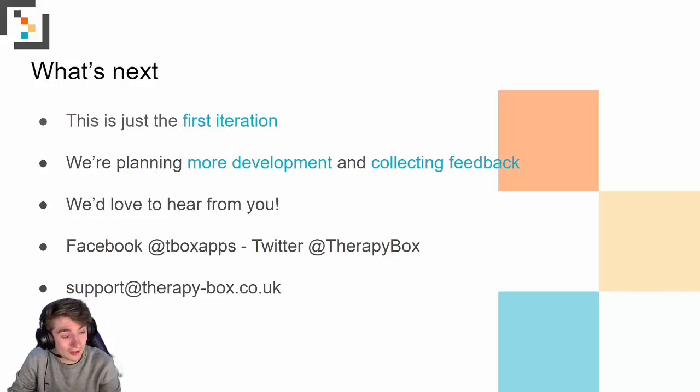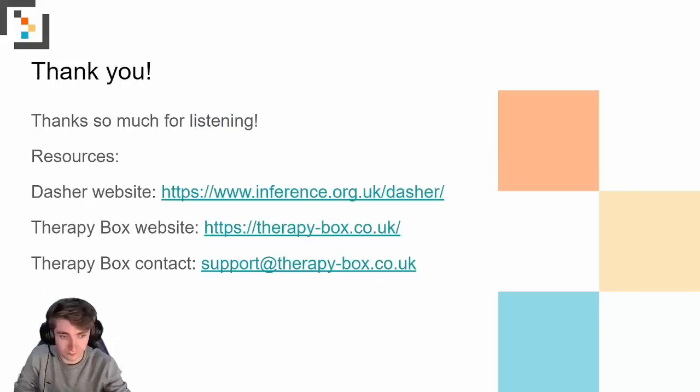Our goals for the future are to include more Predictable features in that main screen, so making the blend and work between the two apps as seamless and easy to use as possible. But we want to, like I said, retain as much of the Predictable feel as we can while getting the full benefit of Dasher.